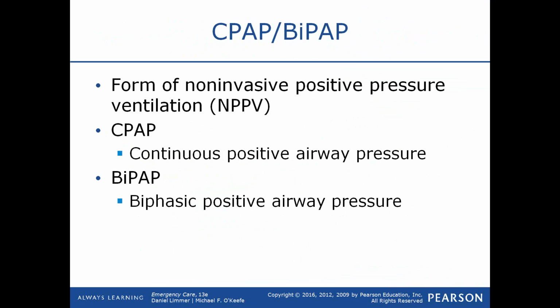CPAP and BiPAP: it is within the scope of practice in Iowa for you as an EMT to administer CPAP with medical director approval and training.